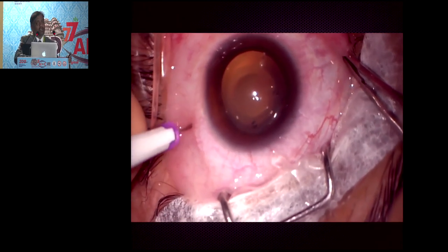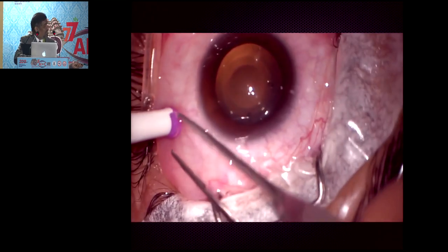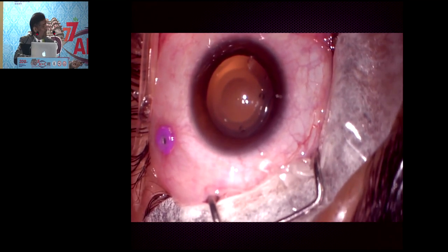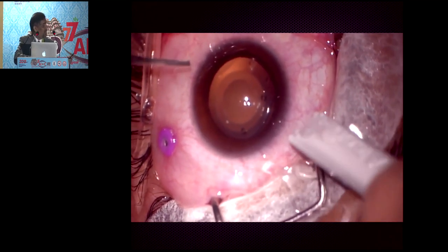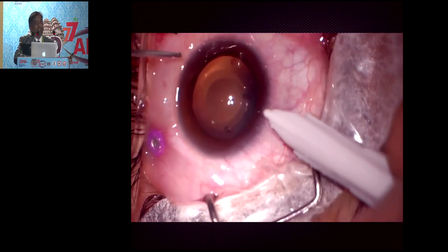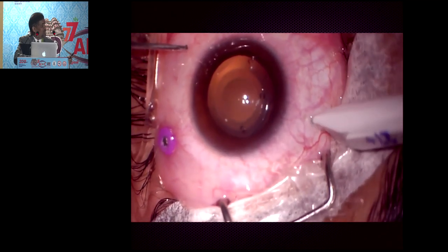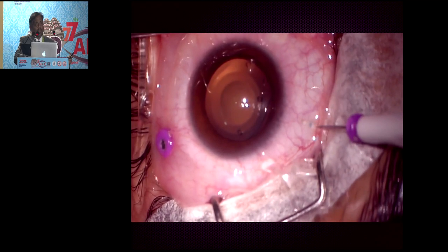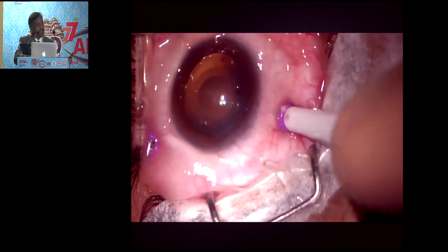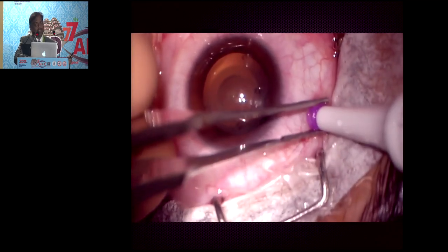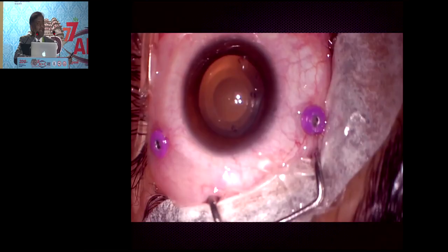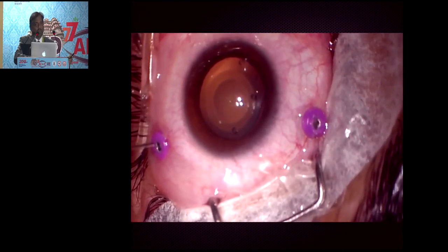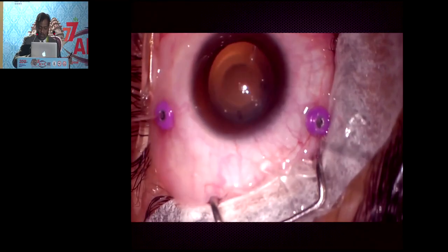In this case with a phakic IOL, the light pipe side can be at normal 3mm, but for the active instrument, take it further posterior. Before doing that, confirm the ora is slightly posterior by doing depression. In this way, reachability towards the posterior pole is increased during vitrectomy.